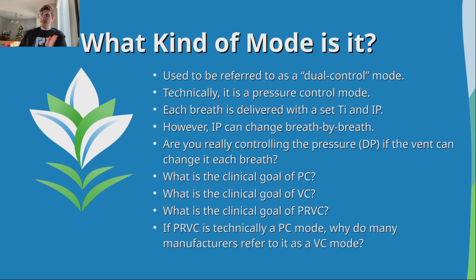This is a question that I'm bringing up because sometimes you get asked it in interviews. Sometimes they'll ask this question at school or whatever. It's kind of a hot topic. Now, we used to refer to, and by we, okay, not me, but researchers used to refer to PRVC as a dual control mode. And the reason they did is because it's trying to mimic volume control, but giving pressure-controlled breaths. But nowadays, the researchers say, well, actually, it's a pressure control mode.